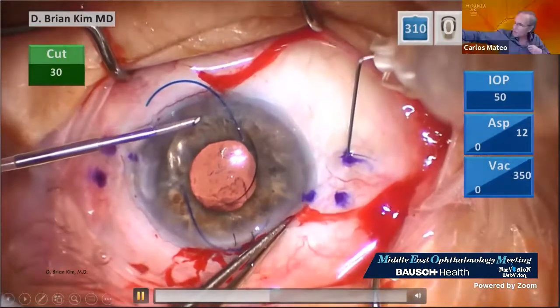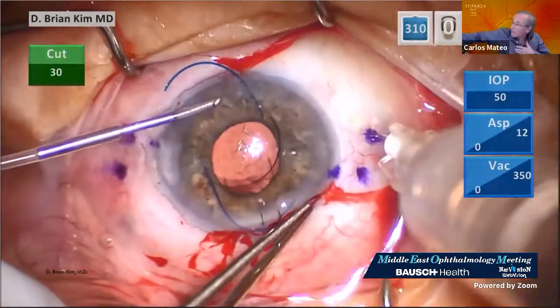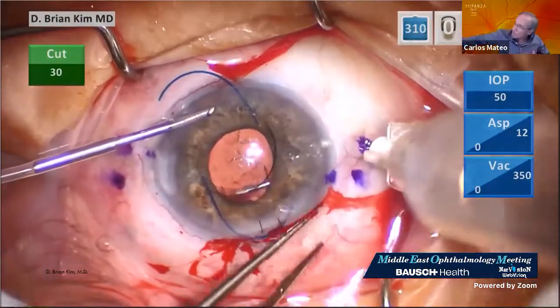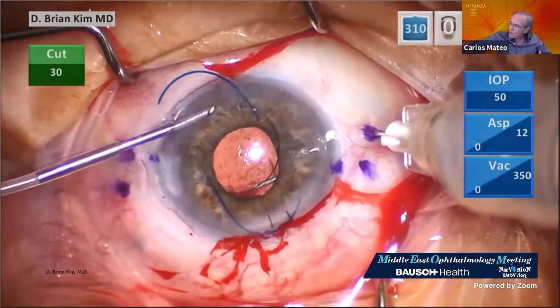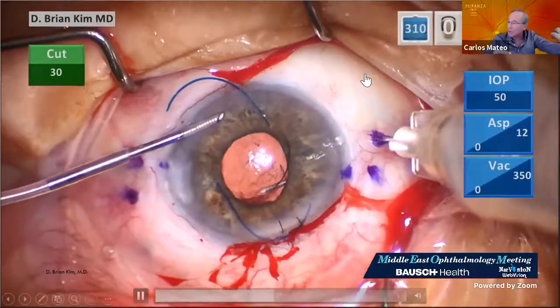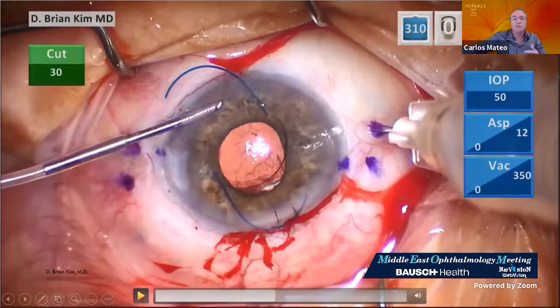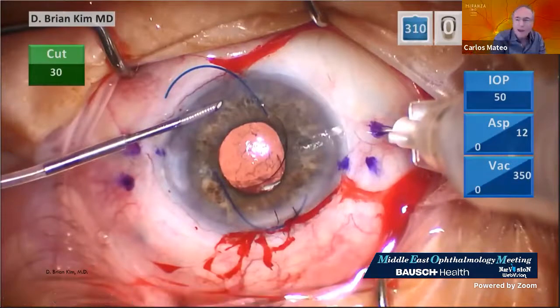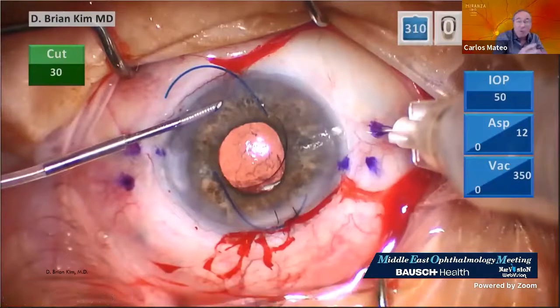Okay. Look at this. This is the same problem. The same thing. Look at this. Now take a straight line between this and the end of the needle. It's not the same. You have 3 points here. Then the tunnel breaks. This is my main problem. This is great, but my main problem is that you make 2 millimeters, but at the end you break the scleral fibers in small pupils.